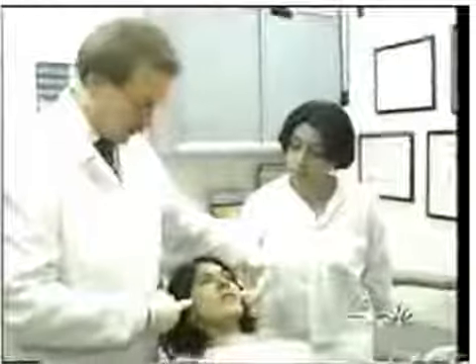When Olga Maggio had a crown placed over a bad tooth, she thought her dental troubles were over, but it was only the beginning. "I always had problems trying to adjust the bite, and it never felt good. So my jaw started hurting, and then it started popping and clicking." Olga's pain was due to a misaligned bite. "Ideally, when we bite together, we'd like all teeth biting with the same amount of pressure at the same moment in time. Rarely does that happen." About 80% of Americans have a bad bite, putting them at risk for broken teeth, TMJ, and other problems.